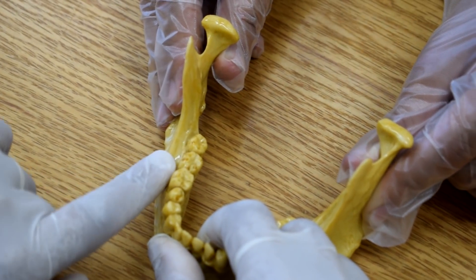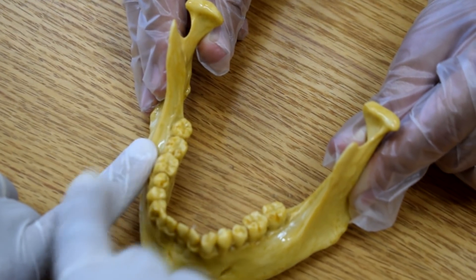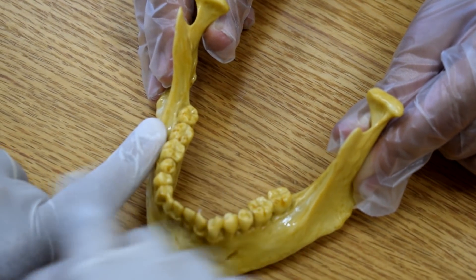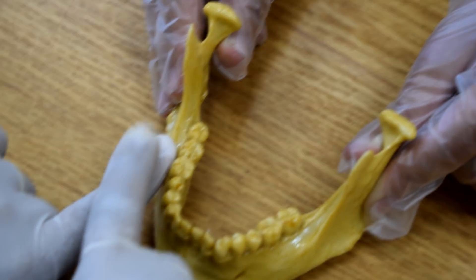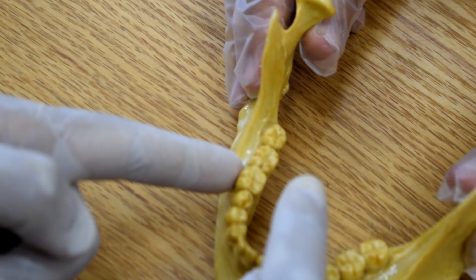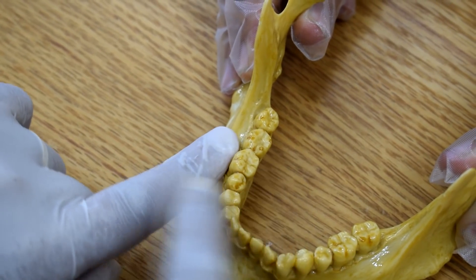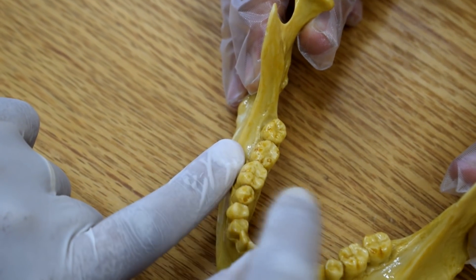I felt it. Then my finger — I have to notice that my index finger is placed so that my fingernail is facing upwards and parallel to the occlusal plane. Not like this, not like this, not like this. It will be so difficult if you proceed in another way, especially if you have no experience.